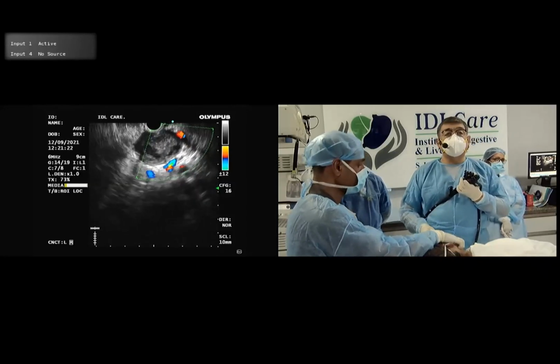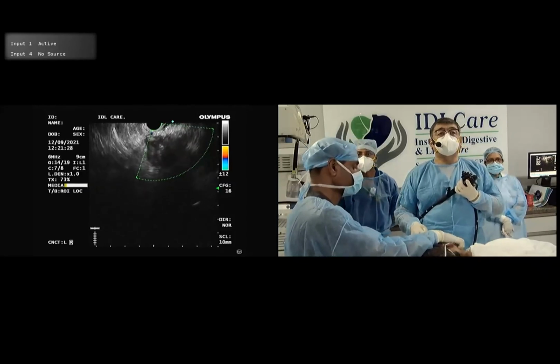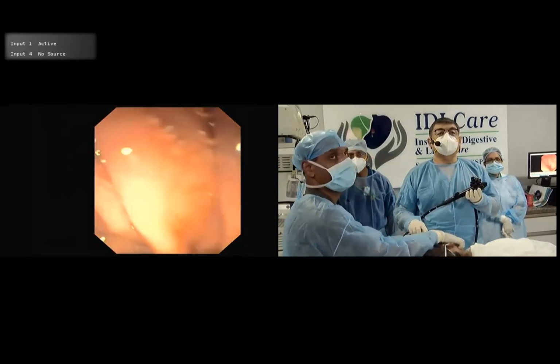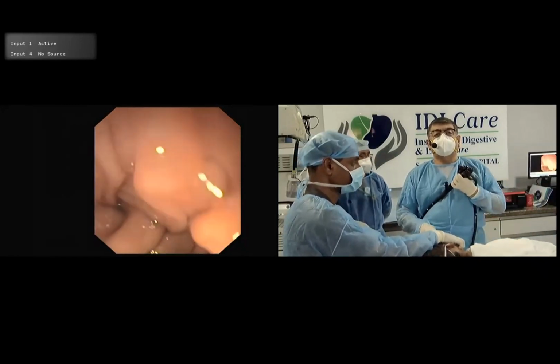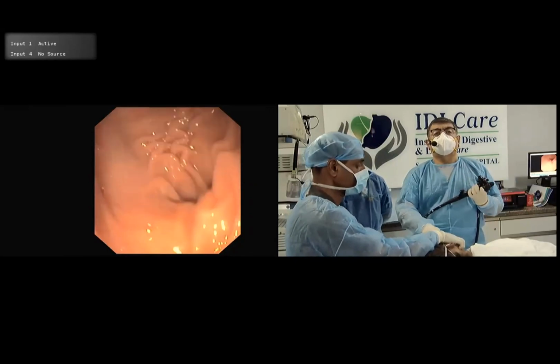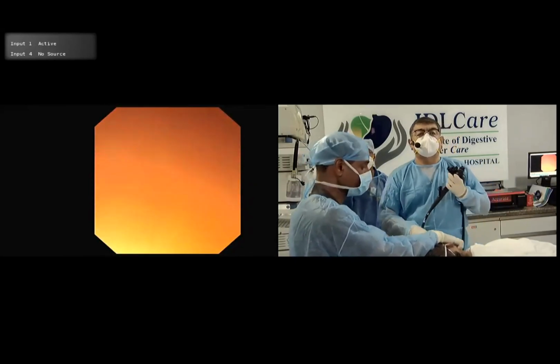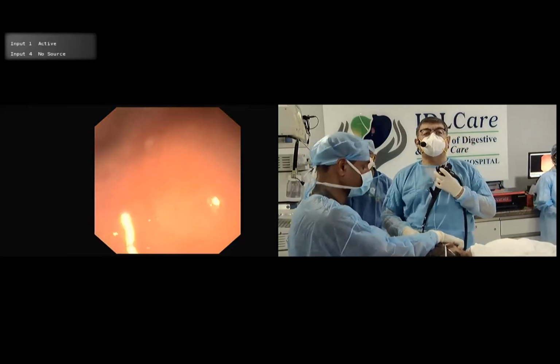Now let us go into the duodenum and see whether we are correct. So you see this, all this information is from the proximal stomach. Now we confirm it by going into the duodenum. Amylase lipase, by the way, was normal. So maybe he had some pancreatitis long back. Now we are seeing the residual. So I am in the bulb now. Let us see the EUS.